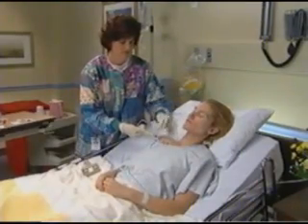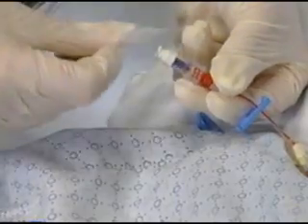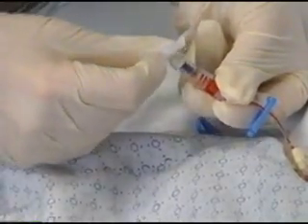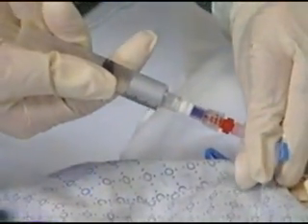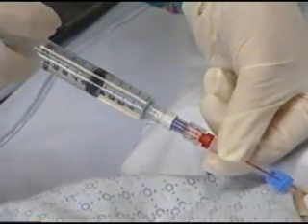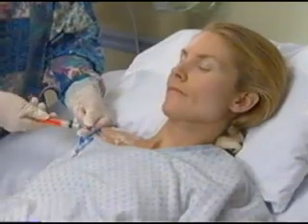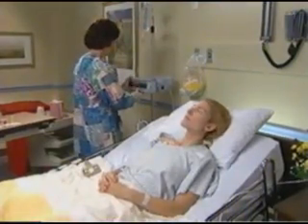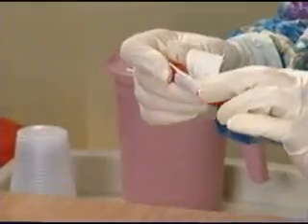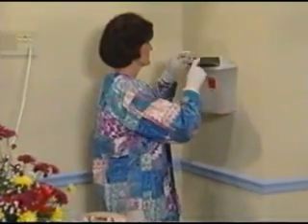catheter. Remove the vacutainer. Clean the injection port with alcohol, unclamp the catheter, and flush it according to your facility's policy. Then reclamp the catheter, remove the flush syringe, and restart or reconnect any infusions as needed. Label all specimen tubes. Finally, dispose of any sharps in the appropriate container.